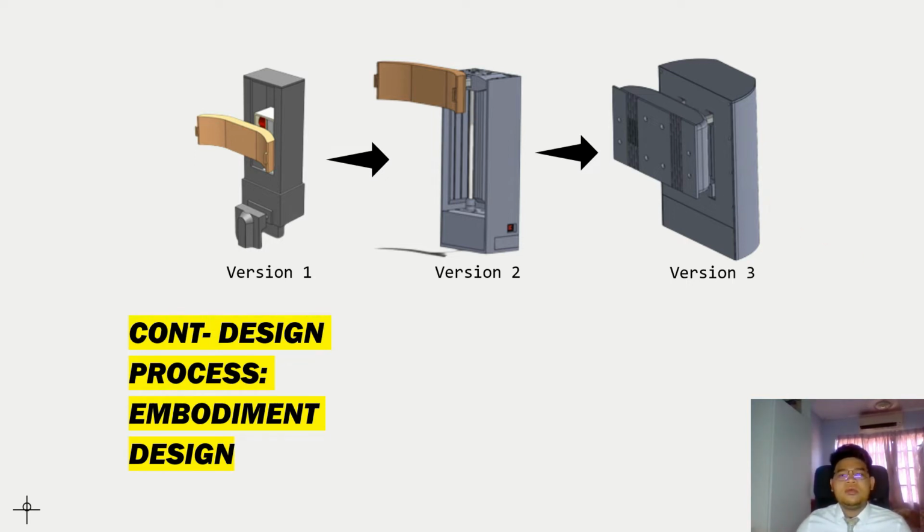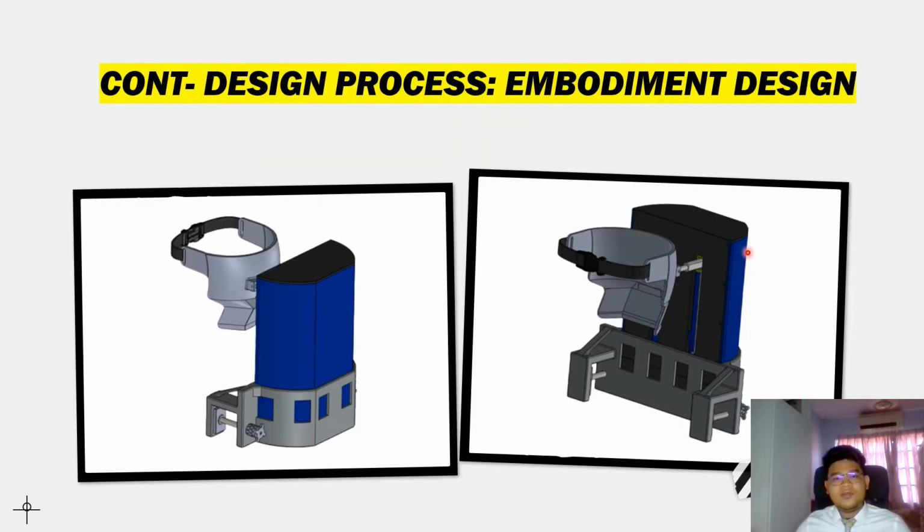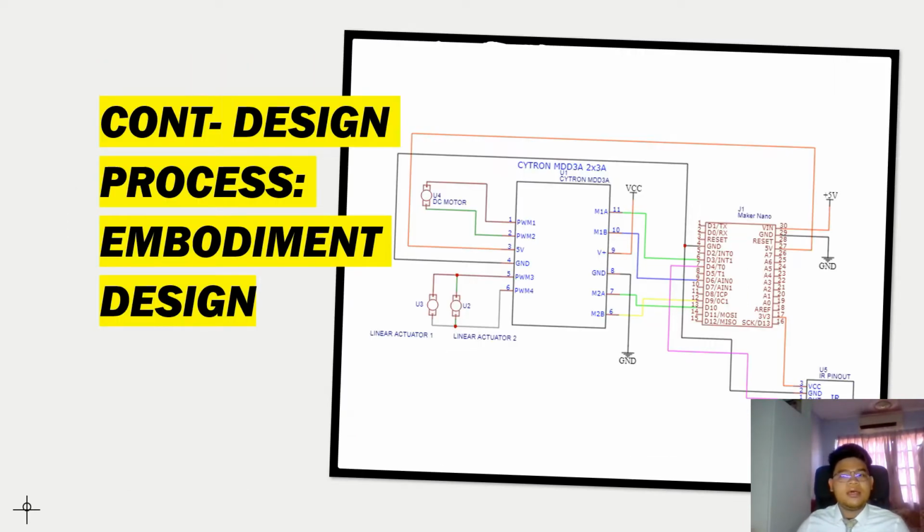Okay. So the 3rd version and the 4th version are actually quite the same. The difference is in the design of the headrest. Why I chose this type of headrest is because I found that during the fabrication, the 3rd version is very heavy. It weighs 1 kilogram, and this proves that the worm motor can carry it, but the track that is inside this thing cannot handle it. So it can only move in one direction. It cannot move downward. It cannot move outward.